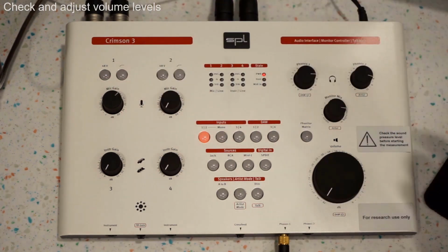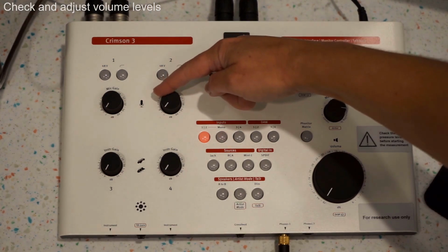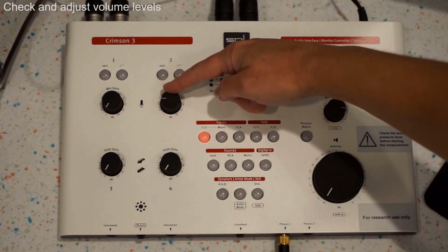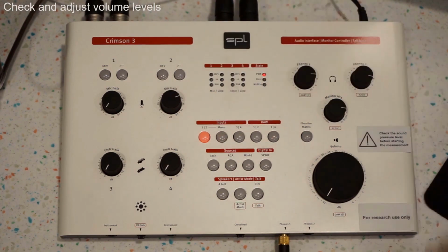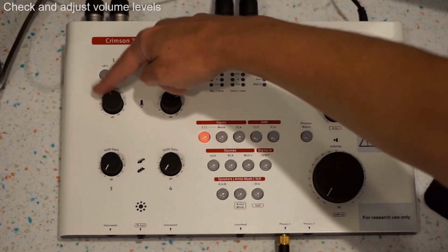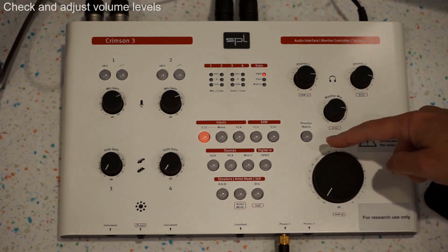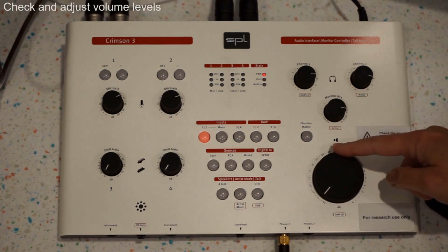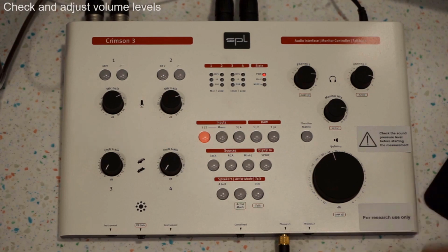Record the value. Return to 7 dB. Slowly increase the right mic gain until the subject can hear the tones. Keep the right threshold at this value and adjust the left threshold to the recorded value in the previous step. Add 60 dB to the recorded hearing threshold for stimulus presentation by adjusting the volume dial from -78 dB to -18 dB.